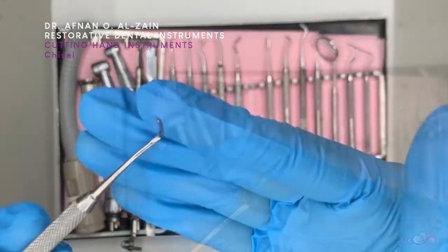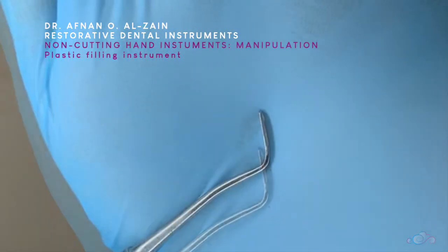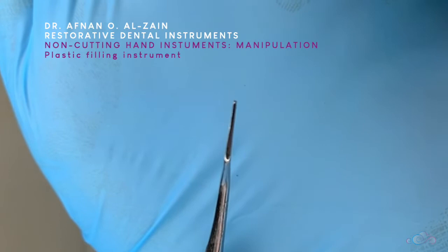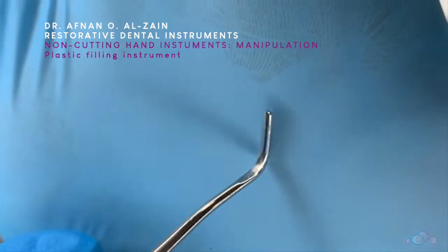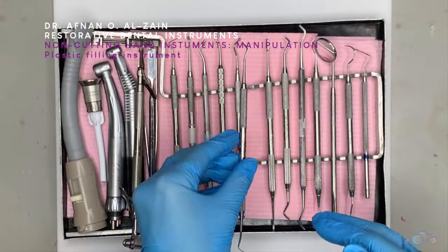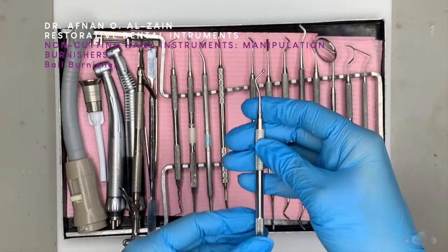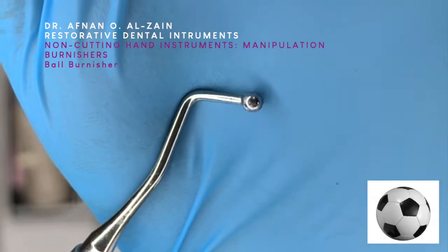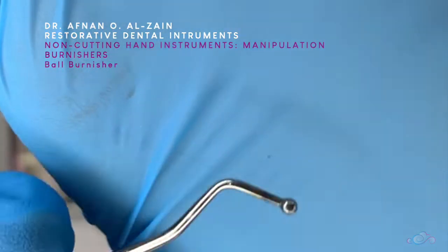After that we go to the manipulation instruments, or the non-cutting instruments. We have the plastic filling instrument, which usually comes double-ended — one side is flat and the other side is pointed. This is used for composite material. We also have different kinds of burnishers. This is a ball burnisher, which is double-ended with two sizes.